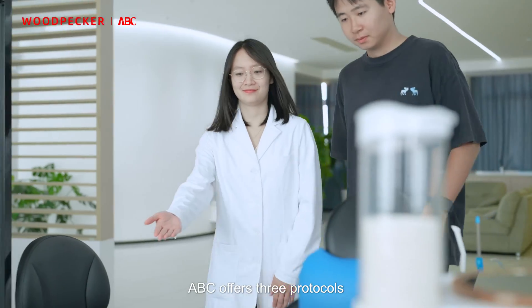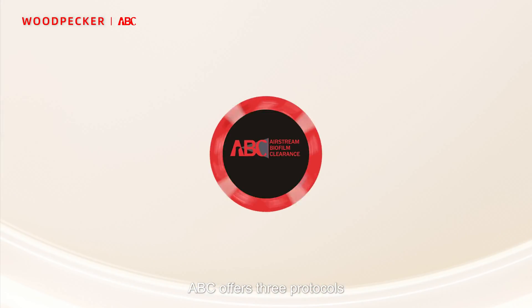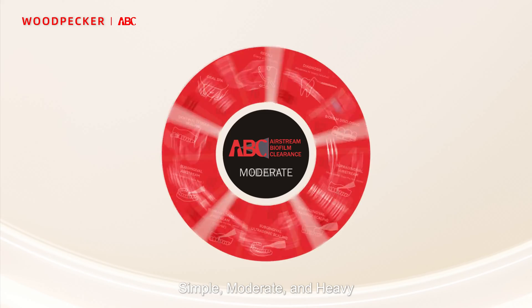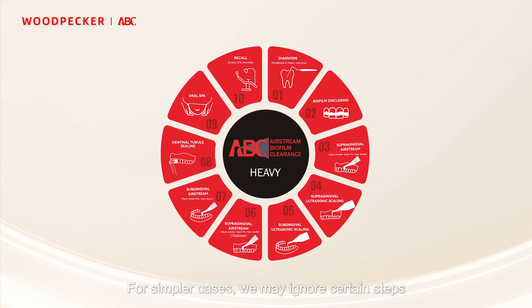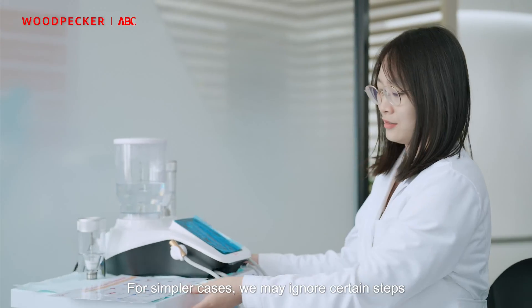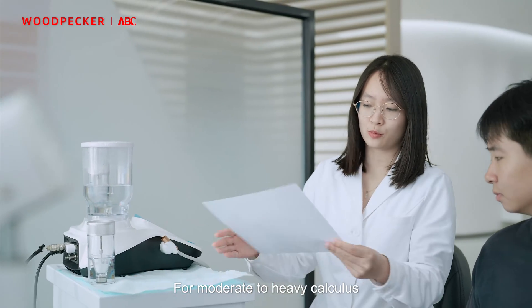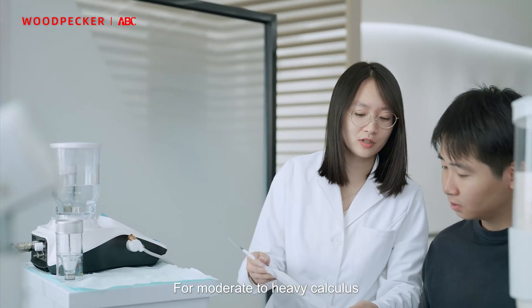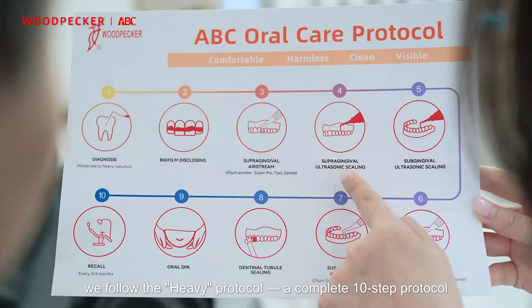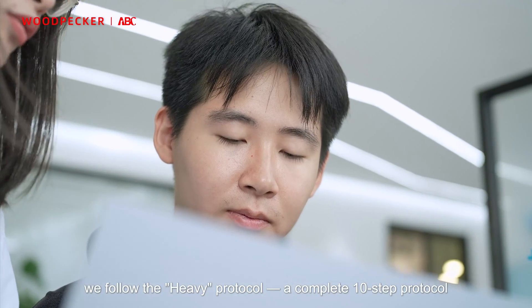ABC offers three protocols: simple, moderate, and heavy. For simpler cases, we may ignore certain steps. For moderate to heavy calculus, we follow the heavy protocol — a complete 10-step protocol.